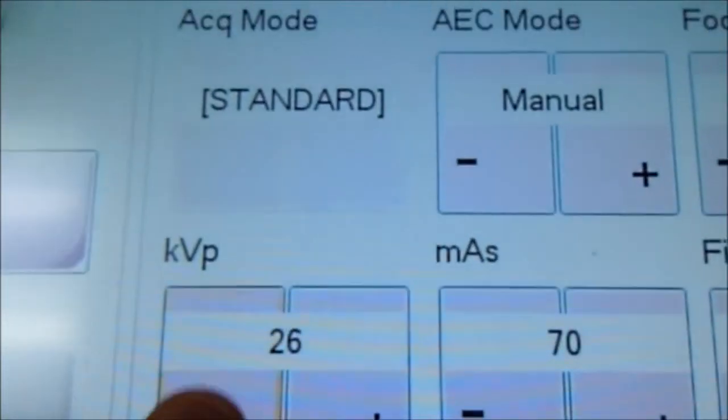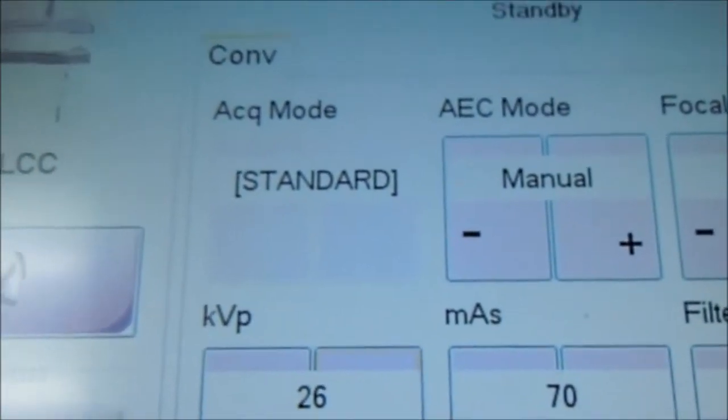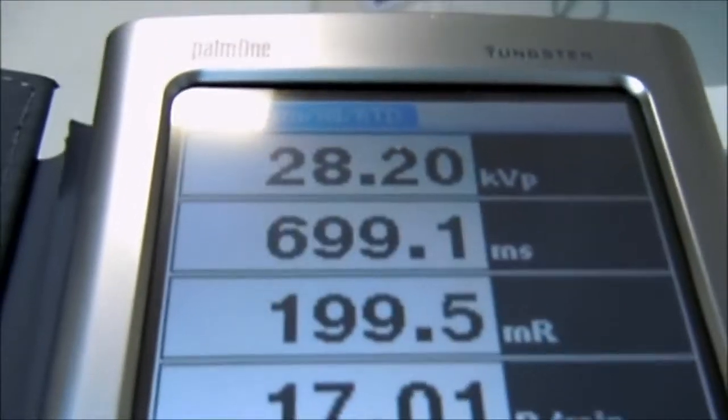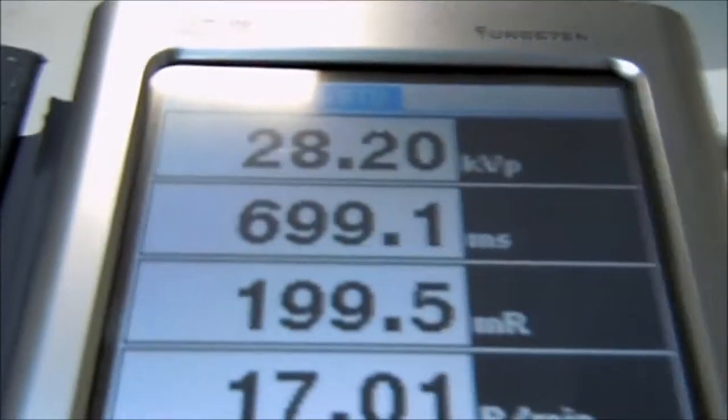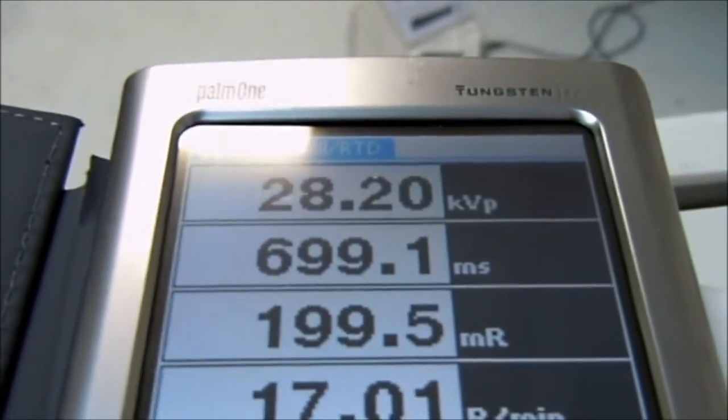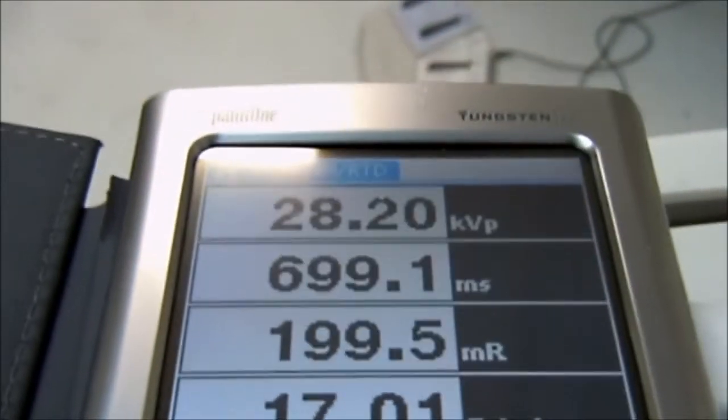So now I go back to KV and I select 25. We'll make an exposure. As you can see, it pops up. And it says 28.2 KV.